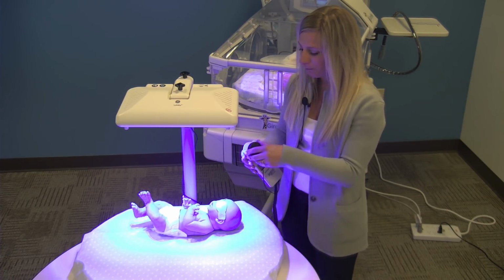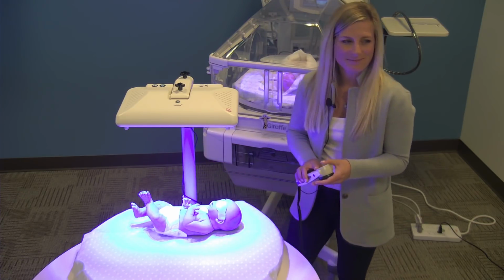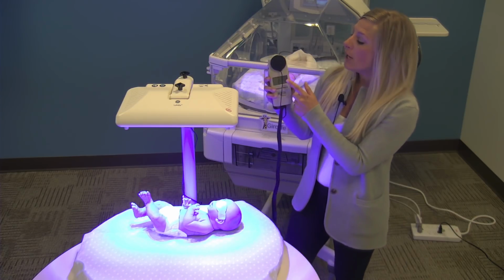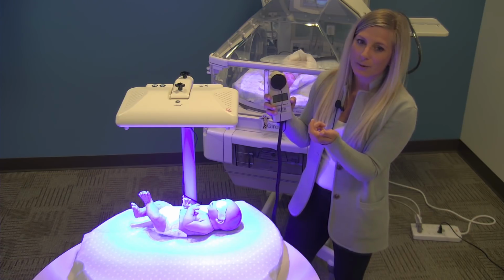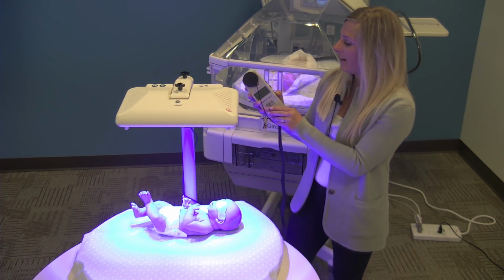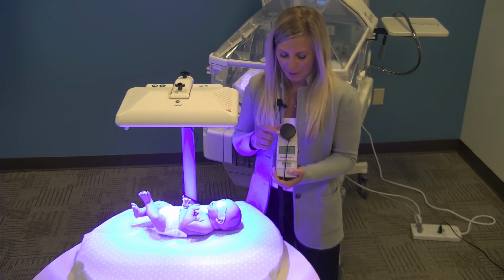So we've got our zeros, and we can just go, whoops, bad teacher, had that lock button in. So that is actually a good example. If you keep that lock button in, you will not be able to get a reading because it'll be locked on your previous setting. So just as an FYI, I will unlock that. I just want to keep you guys on your toes. Make sure you got that bili meter down.